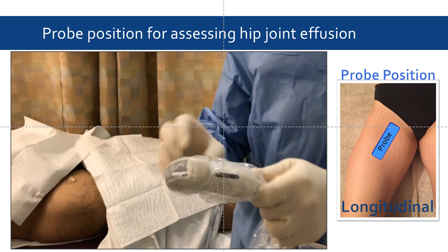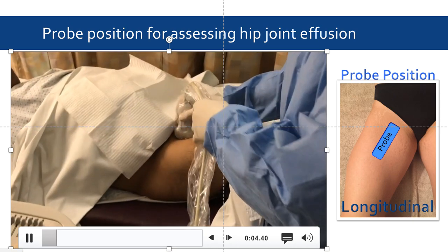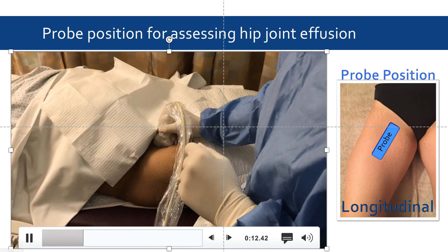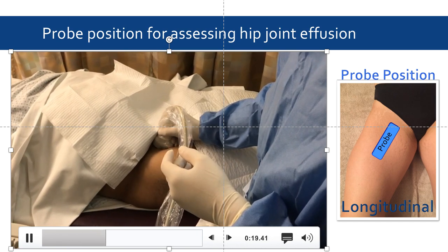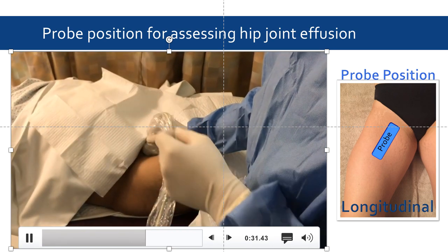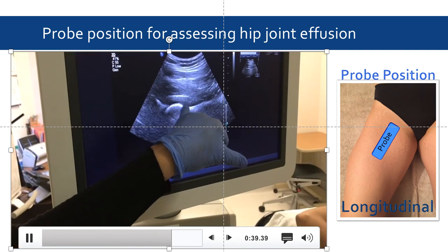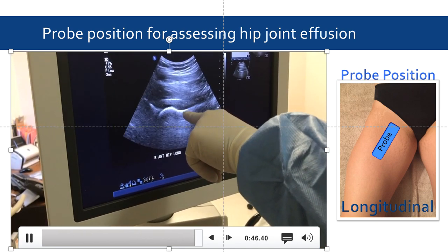This video will demonstrate how to properly position the probe longitudinally in order to obtain an optimal view of a hip joint effusion. Once again, we are locating the femoral head-neck junction, which looks great. There may not be much of an effusion visible, but based on the MRI we know one is present, so we're going to aspirate. Here's the straight femoral neck and here's the femoral head-neck junction.